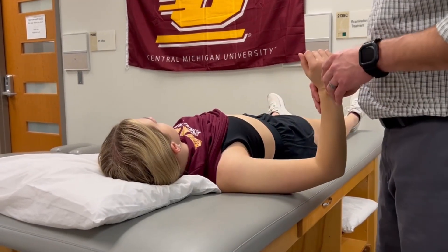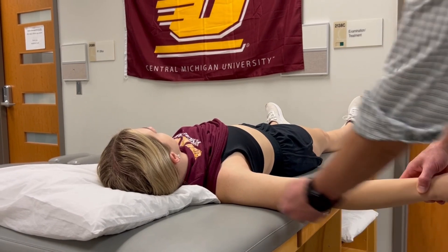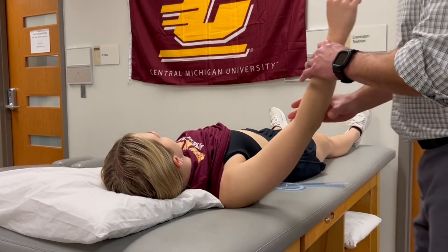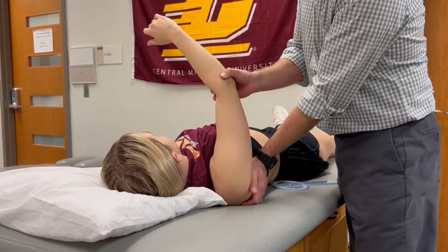Passive horizontal adduction range of motion. Our zero position is going to be out here, so the midline of the humerus is going to be horizontal, and we're going to bring the shoulder across in this cross-body position.